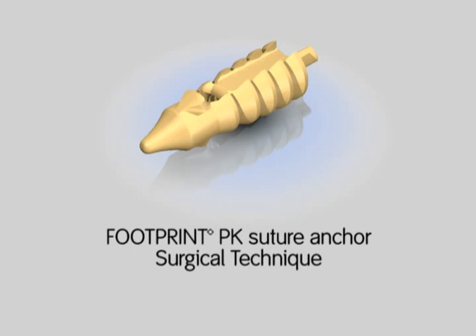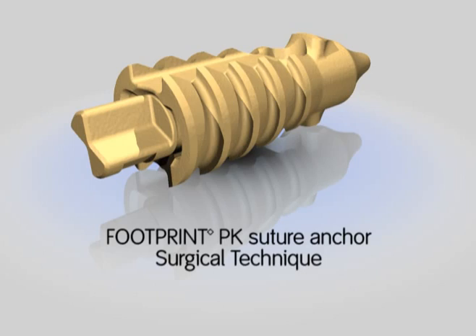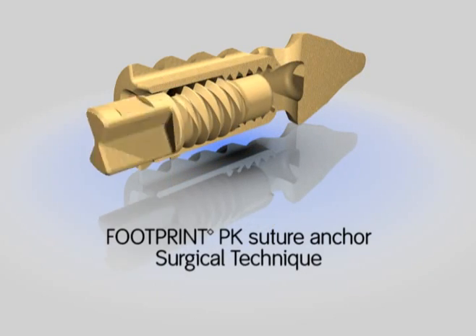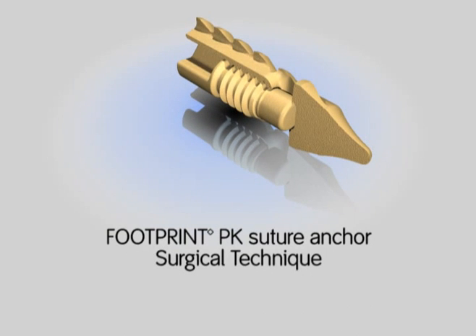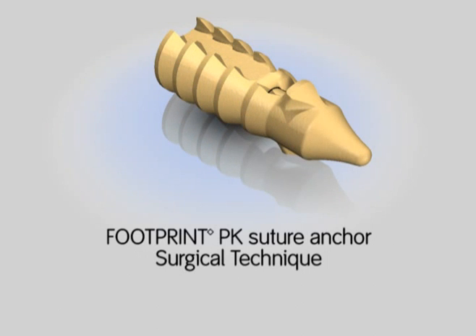The Smith & Nephew Footprint PK Suture Anchor is intended to provide secure fixation of soft tissue to bone. The unique design captures suture limbs from other anchors within the rotator cuff, allowing compression of the rotator cuff tissue to the humeral head between the double row of anchors. The amount of suture tension placed across the cuff tissue is adjustable because the internal plug securing the suture can be reversed, allowing an increase or decrease in tension on the cuff tissue.